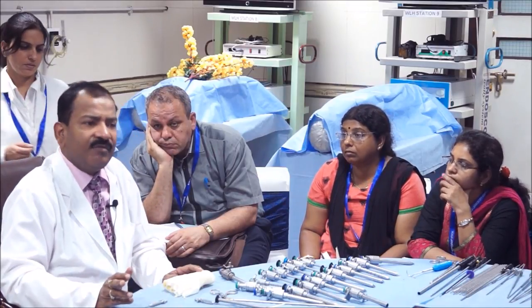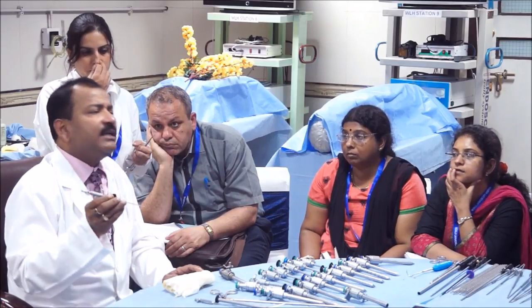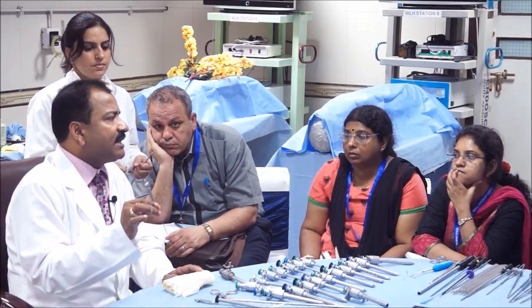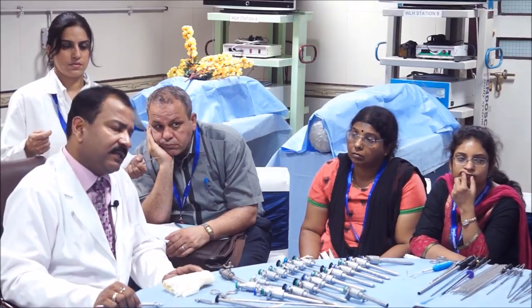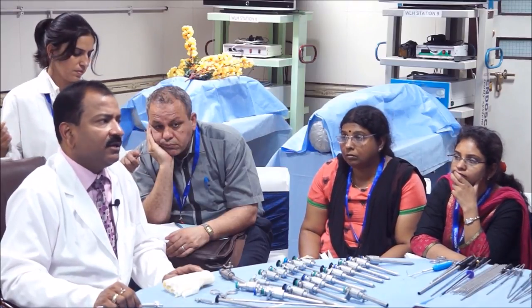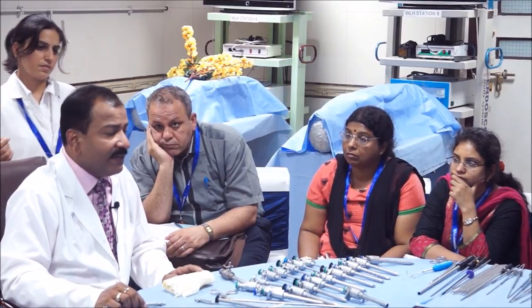First use is very obvious, that is pneumoperitoneum. Second use may be when a huge ovarian cyst is there. If you want to aspirate, you can go percutaneously and aspirate it. Or maybe some dermoids. Yes, in cholecystectomy sometimes, if you want, you can use it. But basically we use an aspiration needle. There is a separate needle for that.